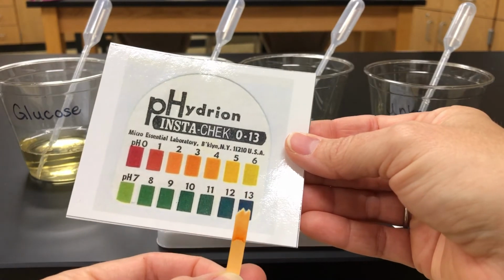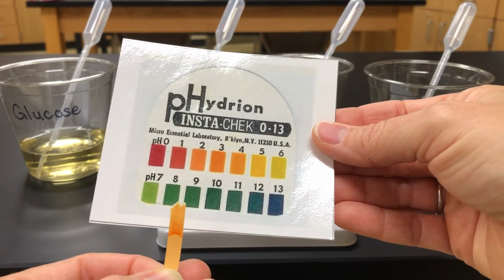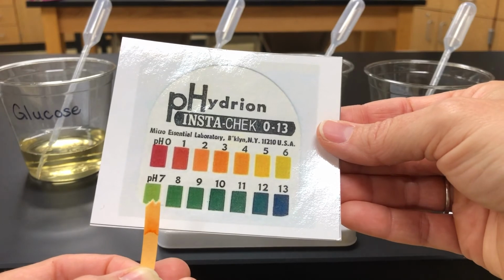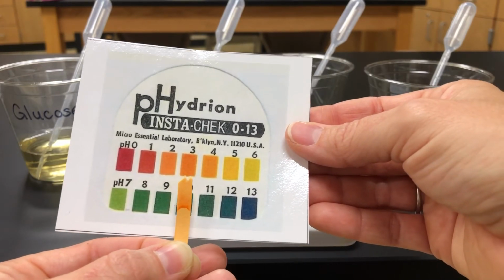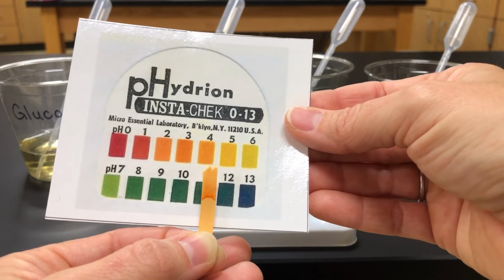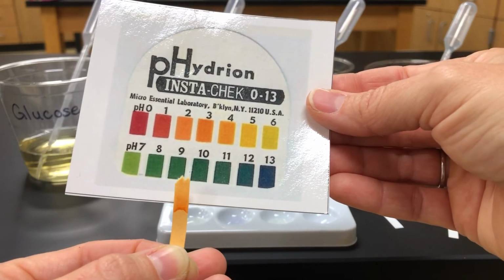And again, you're going to write your results in the table. This is part A, the very first part. So go back to your table or your information for part A and write down your pH that you think this is.